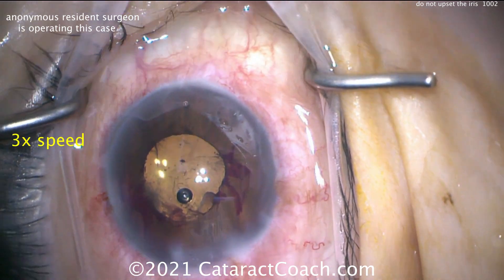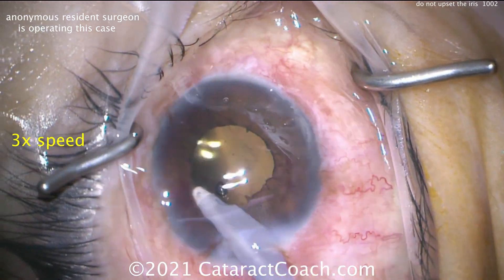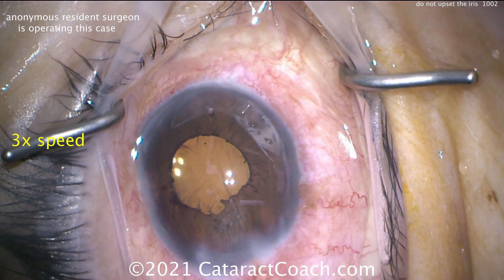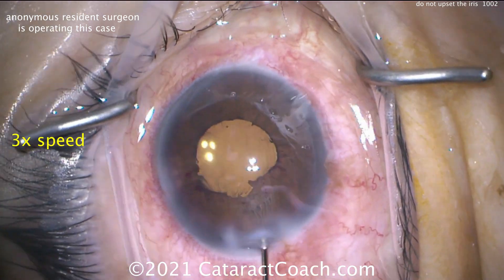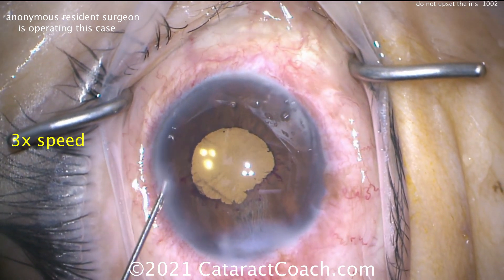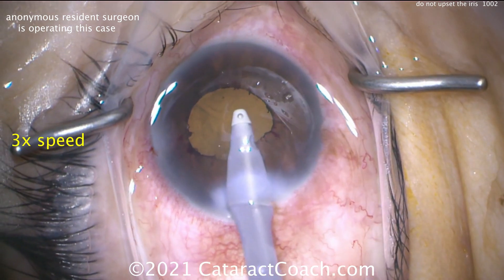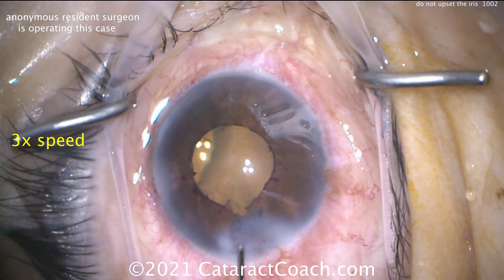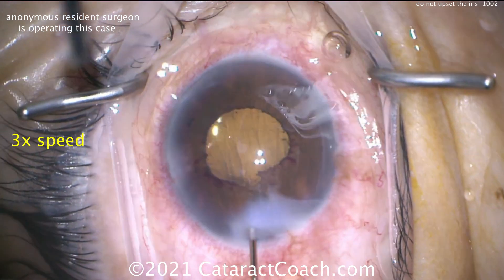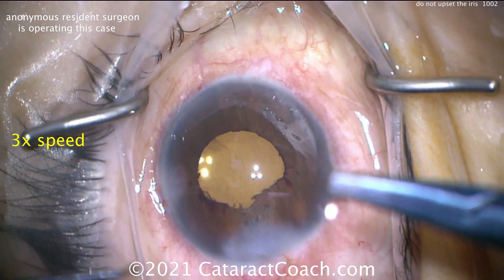The take-home lesson: do not upset the iris. Don't touch the iris — especially with the phaco probe. When you touch the iris, that's what I call manual miosis — you're inducing pupillary constriction manually by touching the tissues. Never touch the iris. And it goes without saying: if this patient was under topical anesthesia, the patient would feel everything when you touch the iris. The iris is not anesthetized with topical anesthesia — so with retrobulbar it's okay, with topical not so much. There's a little more iris prolapse — flatten the AC, release the pressure gradient, seal up the incision. And should you put a stitch in this eye? Does it need a suture? Of course it does, unless you want to see that iris prolapse on post-op day one.